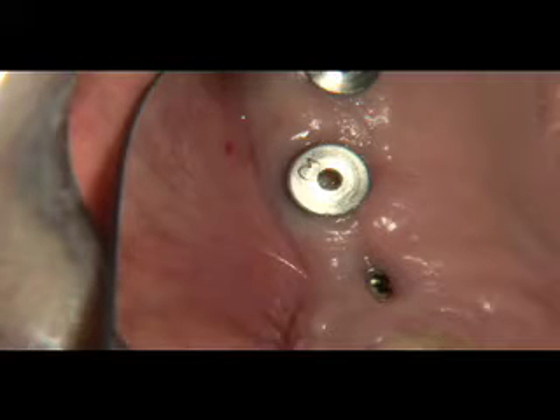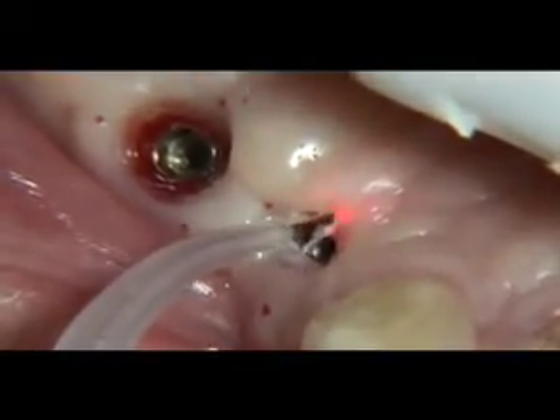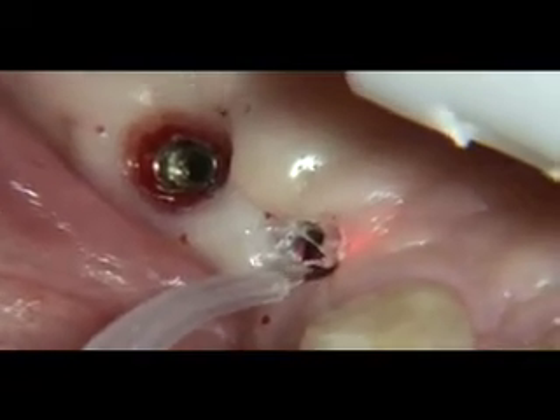When implants are ready to be restored, we will occasionally discover that they are submerged below the attached gingiva. We are then faced with a decision of the best way to expose the implant.